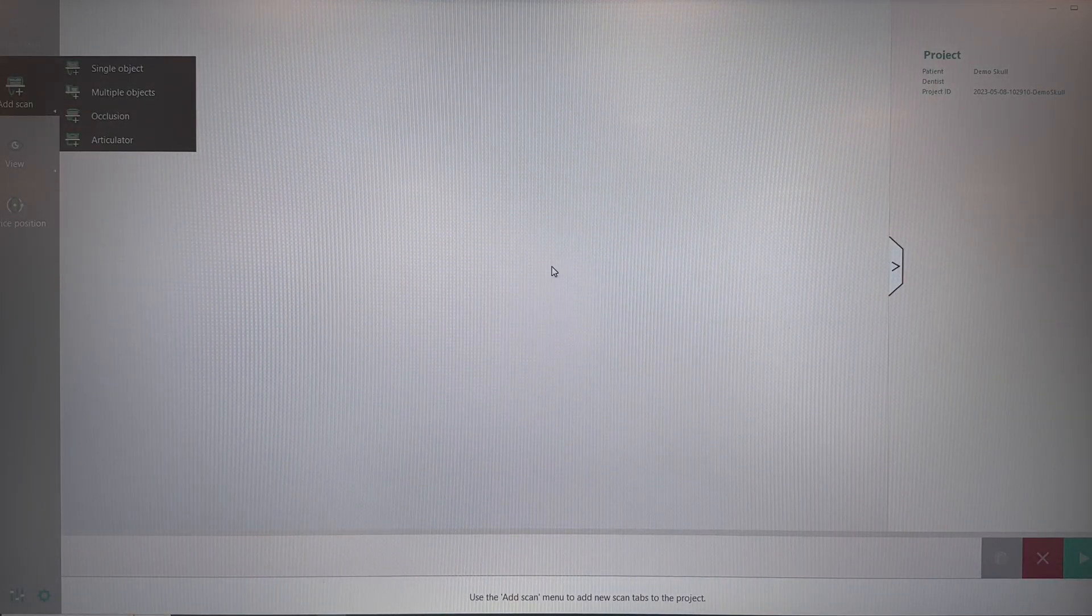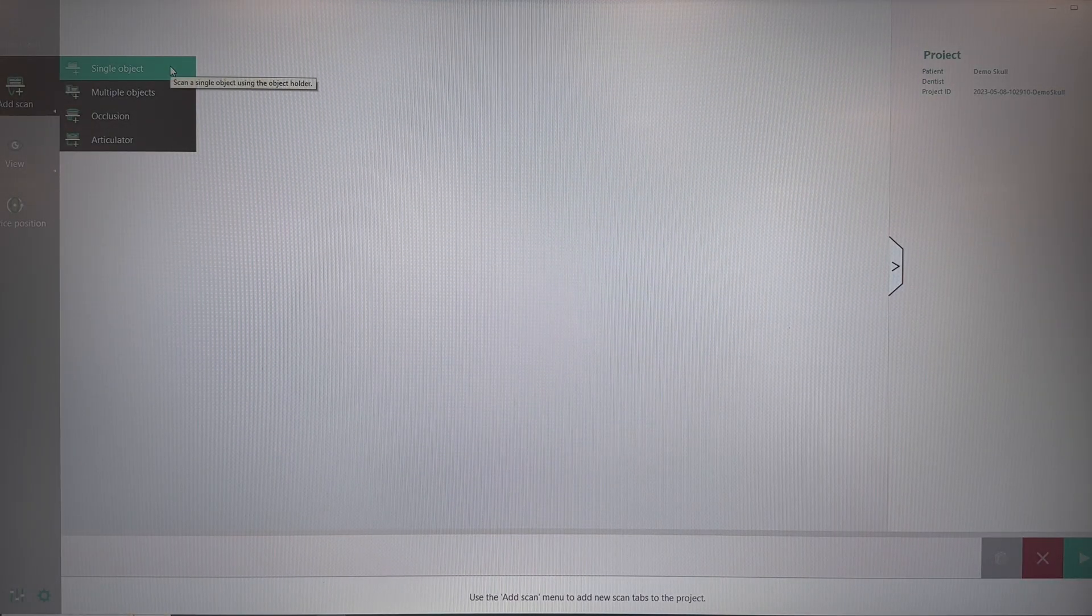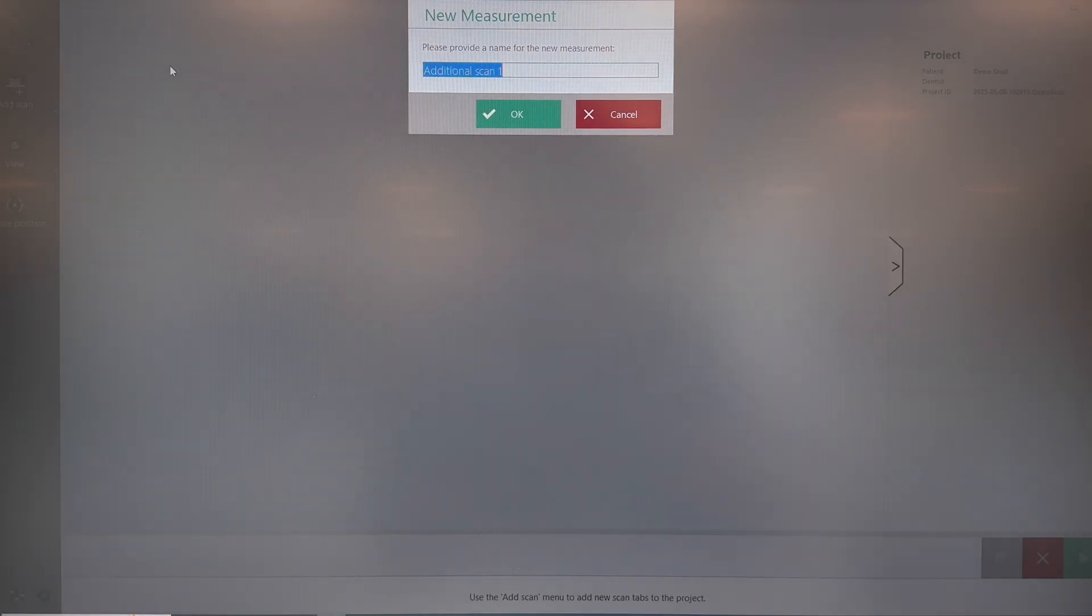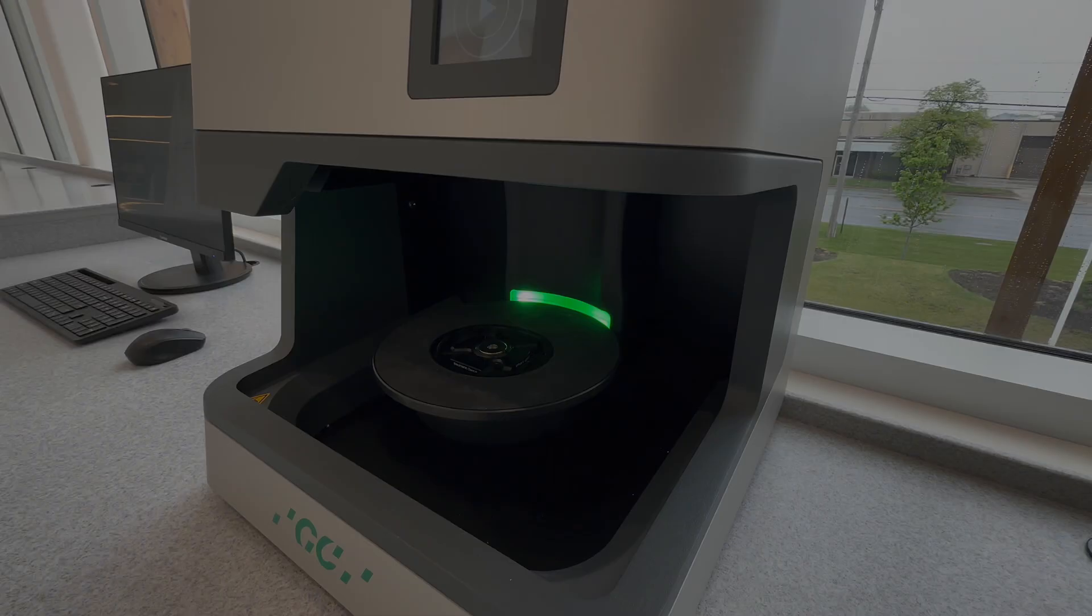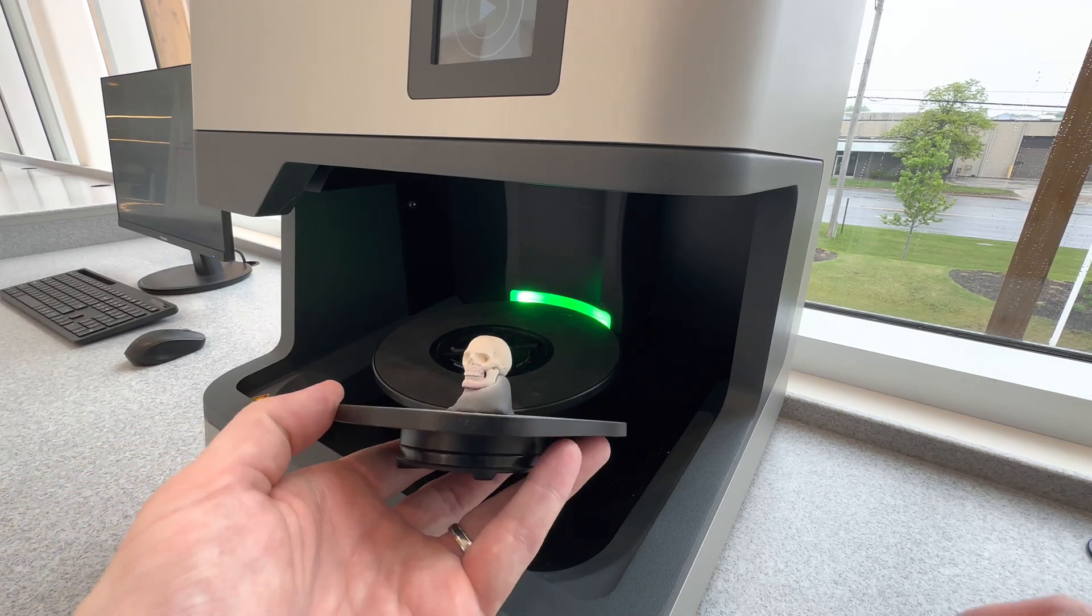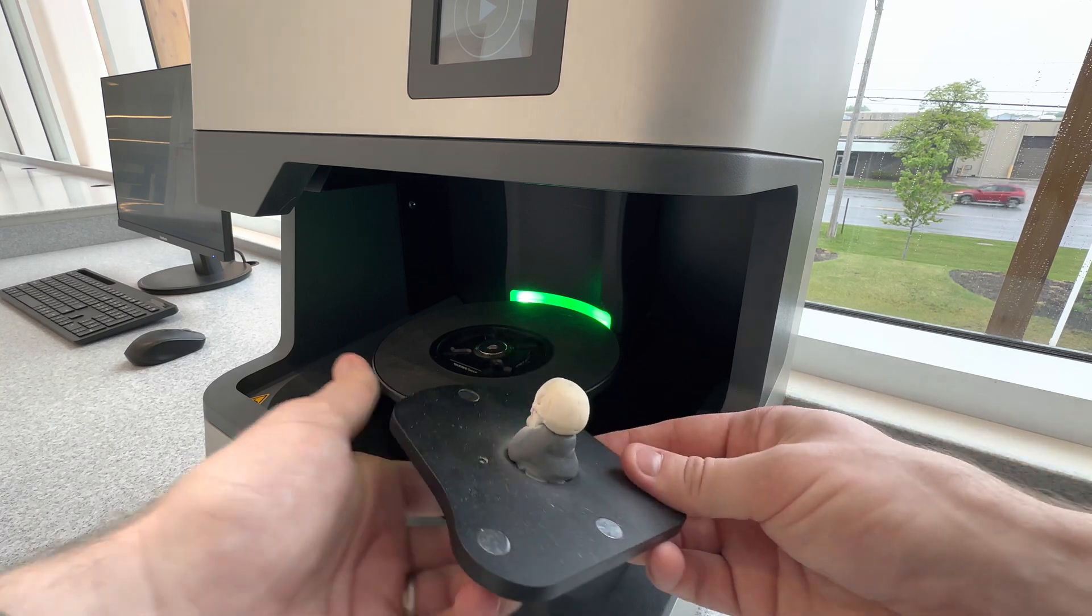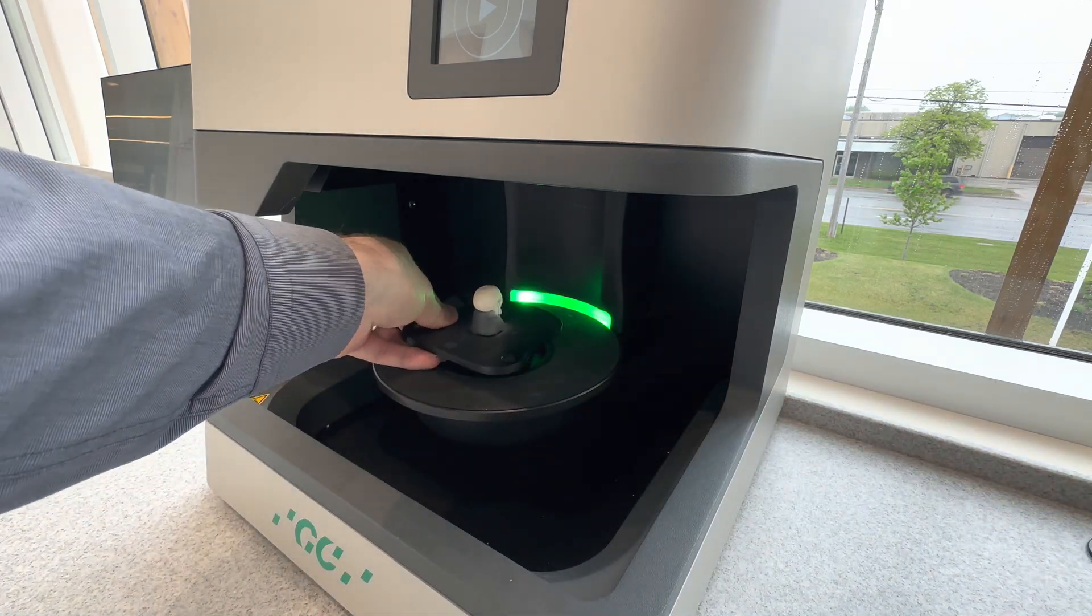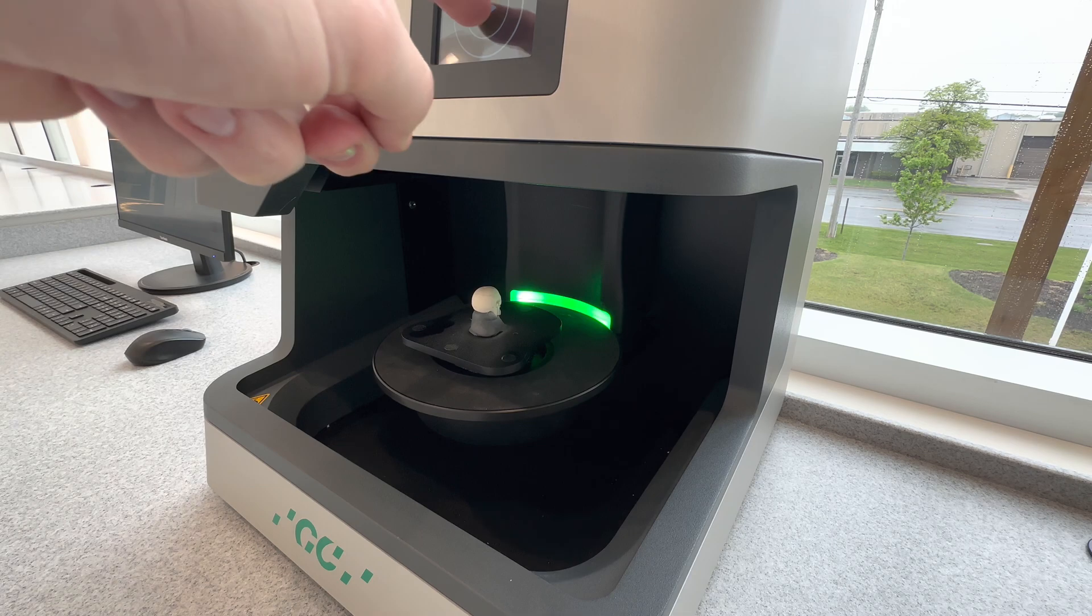On the left side of the screen for Add Scan, we're going to add a single object. Name the object what we're going to scan. For this, it's going to be the top of the skull. Click OK. Now we're going to put the model into the scanner. Once you've done this, press the Start button.